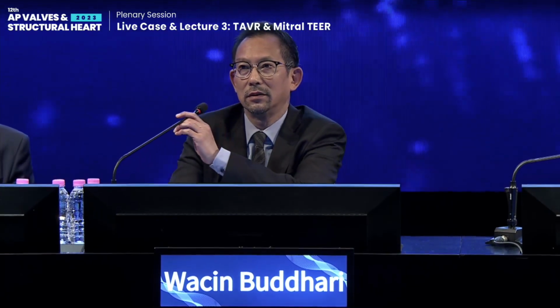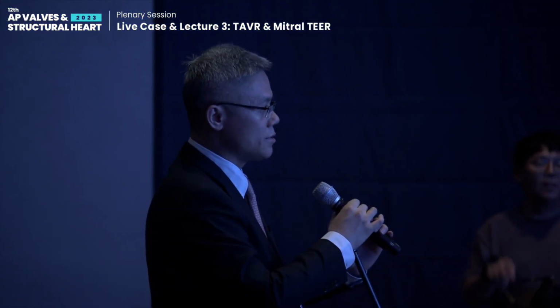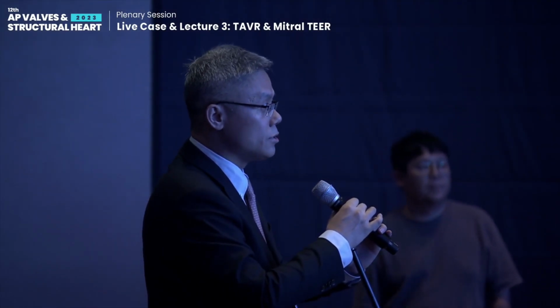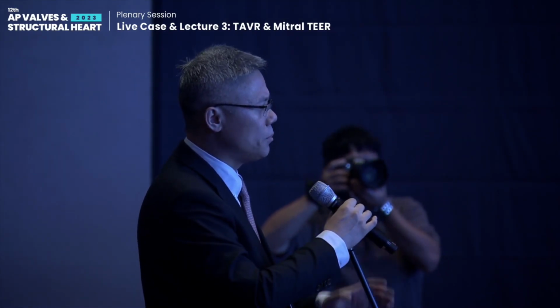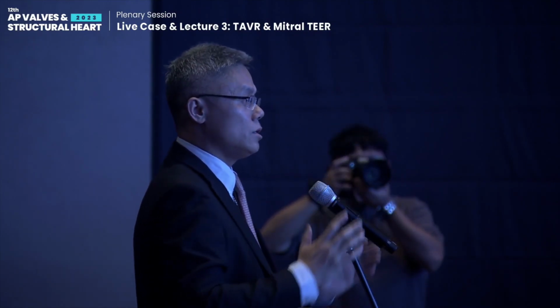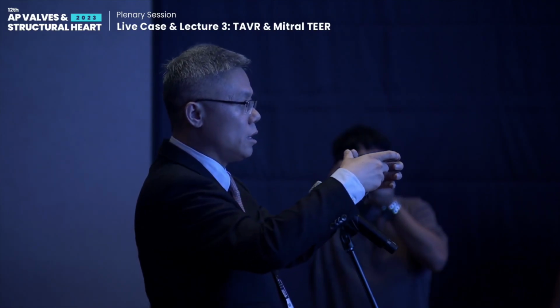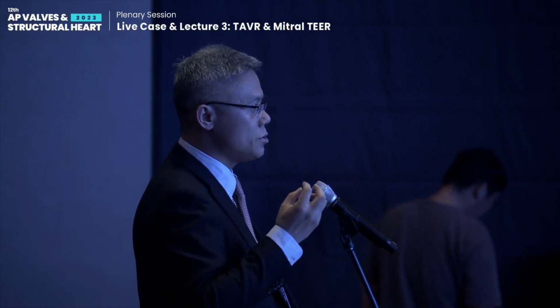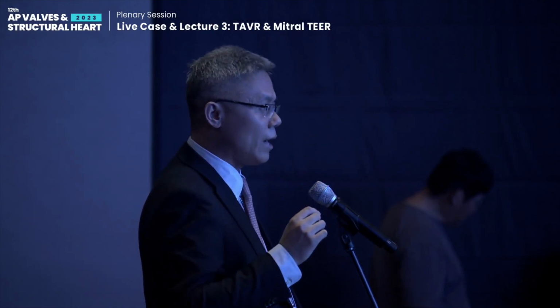Yeah, very important questions. So far, the second generation self-expandable valve for the treatment of AR is still off-label. We only use it in high-risk patients. In terms of VitaFlow, I think the most important thing is the shape. The shape is tubular, very suitable for pure AR, especially for the anchoring zone at the annulus and the LVOT. For the oversize ratio, our center experience is maybe 1.1 to 1.15.